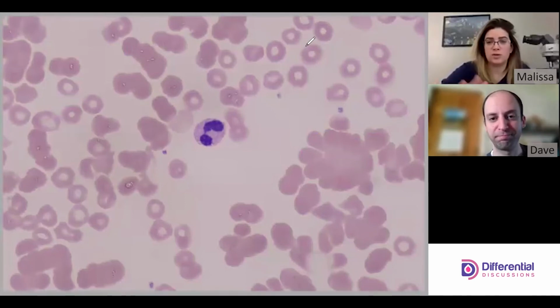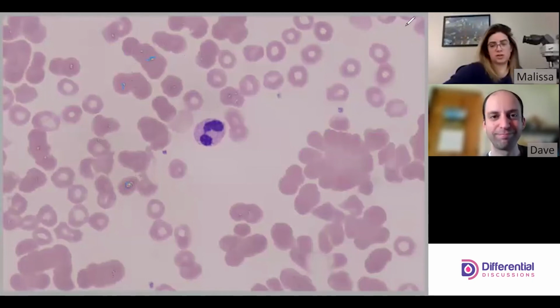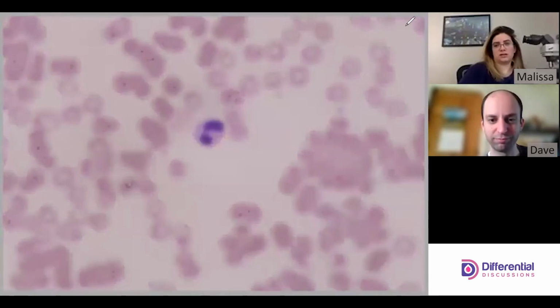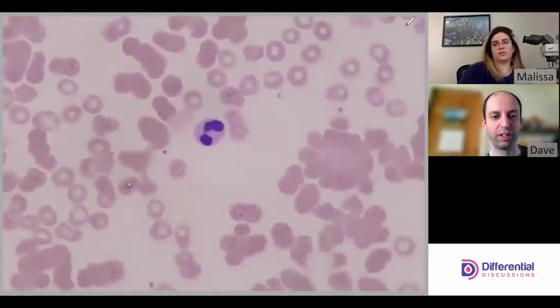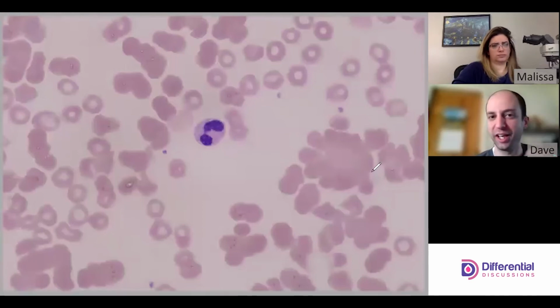Now, it is important to point out that you can kind of see these little shiny marks here, here, here, here. There's a whole bunch of them around. It's just watermarks. It's from the staining process. Let me just play with the fine tune so that you can see that they're kind of shiny. They kind of look like little black marks right there. So that's just something we ignore. It just happens sometimes with staining. Rarely do you have to make a whole new slide, but we see it and we just know to look past it and ignore it as much as we can.